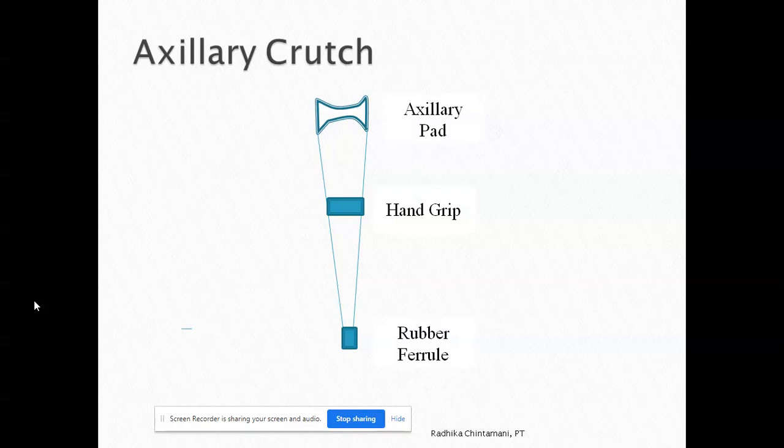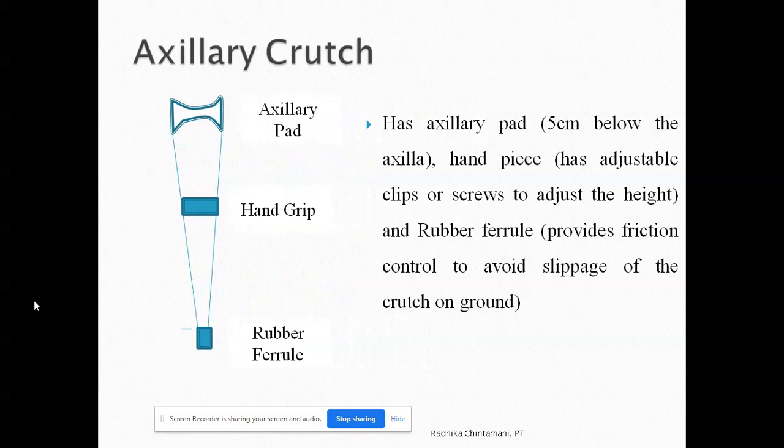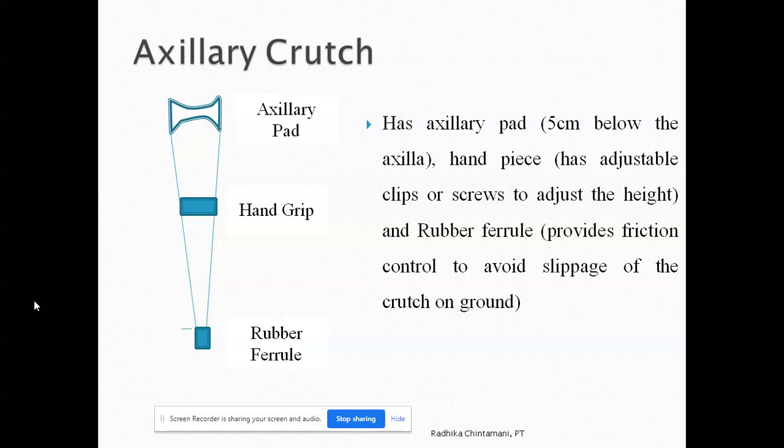Coming to the detailed types of crutches. First, the axillary crutch. The parts of the axillary crutch are the axillary pad, hand grip, and rubber ferrule. Originally it was made of wood, but now it is made of metal. The main differences are that wood gets damaged early while metal doesn't, though metal has a corrosive effect. Also, metal can be adjustable whereas wood cannot.